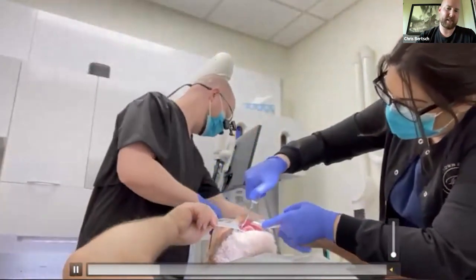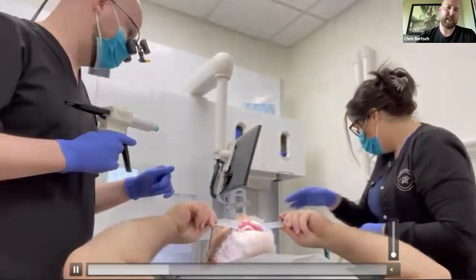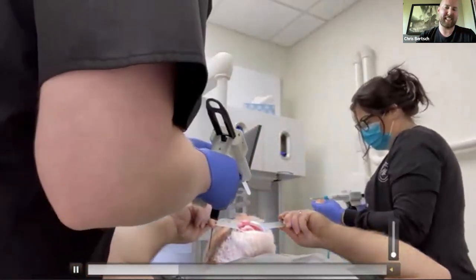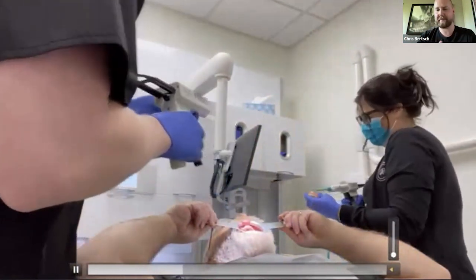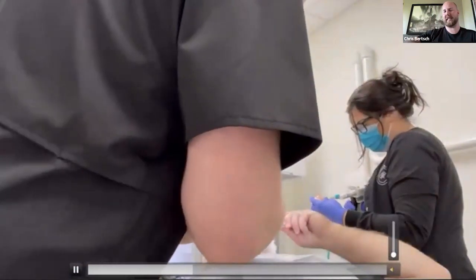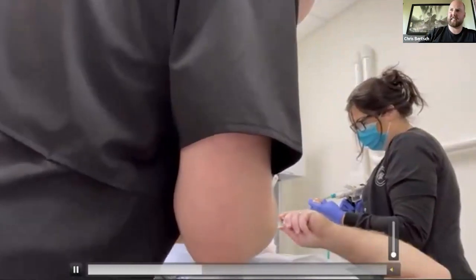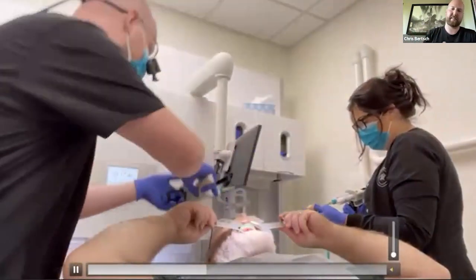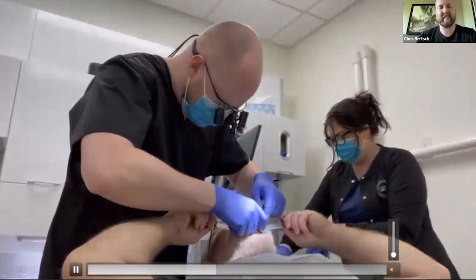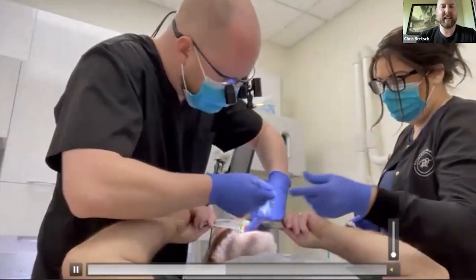And then what I'll do next is take the light body material and put it directly around the vestibule of the patient while the assistant, Stacia, is filling the denture like in the previous video. So I don't do it in this video, unfortunately, but I'll dispense the material around the patient into the depth of the vestibule, and then I'll take an air water and just lightly blow the air just to thin out the material. And then this is why the light body or the slow set's nice, because it gives us more time. And then I just put my finger there.